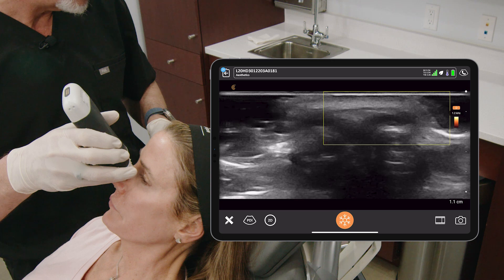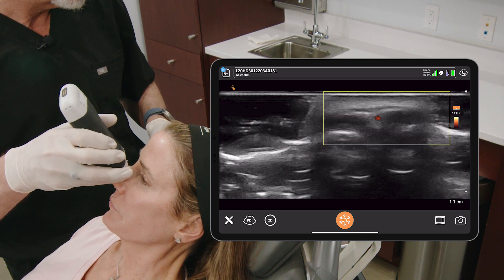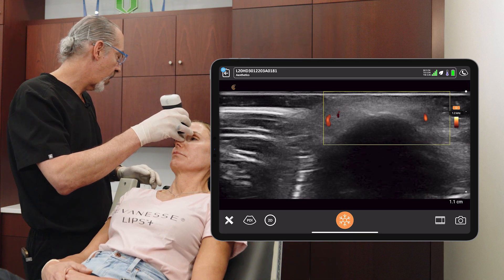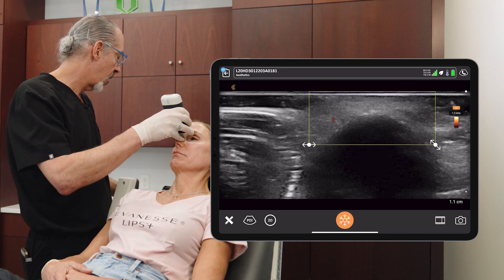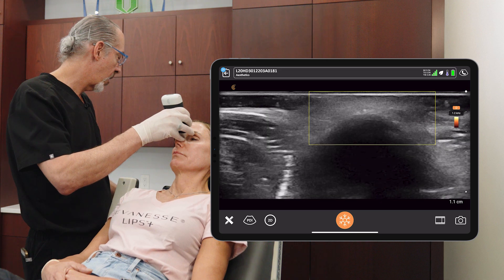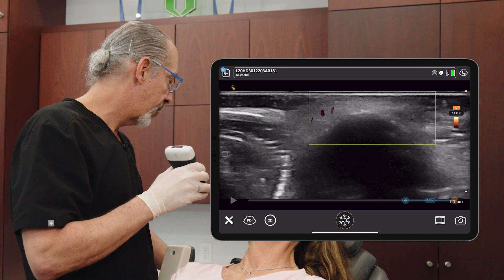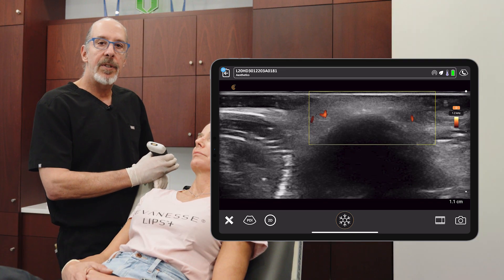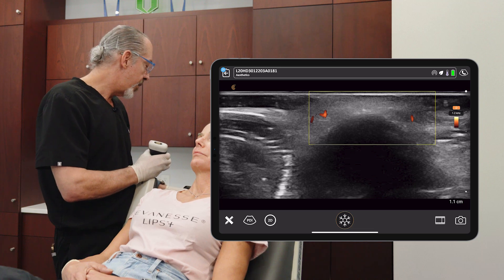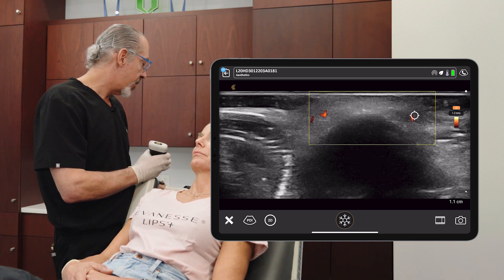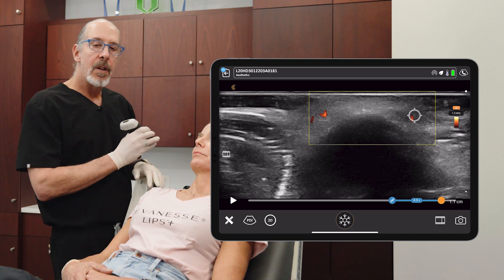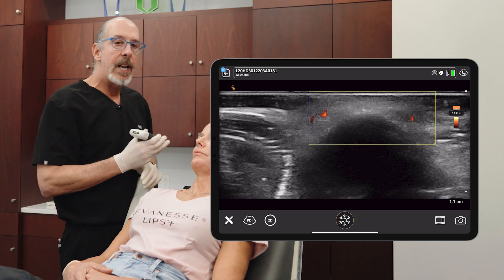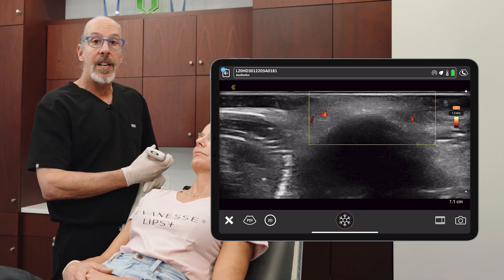This is an area that I'm looking at and I'm looking for the vasculature. What we see here are the paramedian positions of the dorsal nasal artery. This would be the midline, and you see the paramedian position of the arteries. So this patient, in this particular area — which is in the radix area — is a perfect candidate for injections in that area.